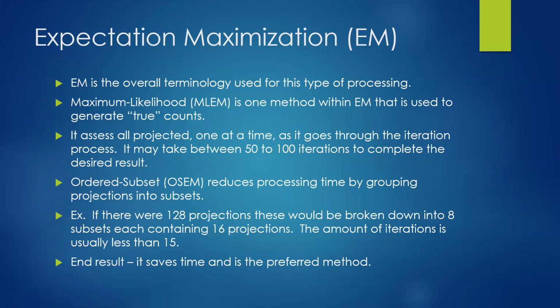There are a couple of different ways that we can look at IR. IR is also known by the overall terminology expectation maximization. One of the IR approaches is something called maximum likelihood, or MLEM. All IR techniques have the same goal, and that is to generate the true counts.